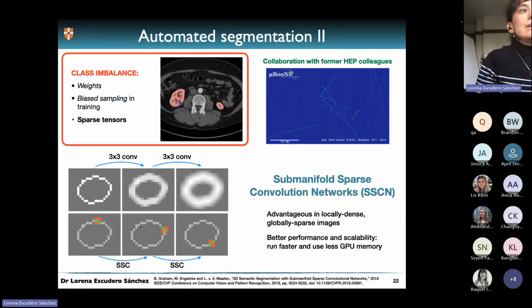They have a slightly different version of a normal convolution, in which, remember, when you are applying your convolution, you are doing it with a window, for example, 3 by 3, and whatever operation you're doing in your kernel, in your filter, can be mean or max or basically any operation, but you would be doing this not just on a pixel, but on a window. So you end up blurring your contours, blurring your image, making it less sparse.